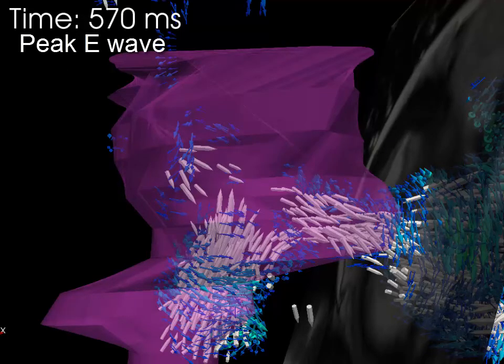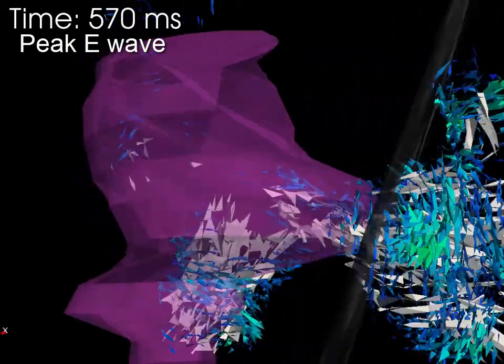During the first part of diastole, E-wave, there is little vorticity in the atrium.